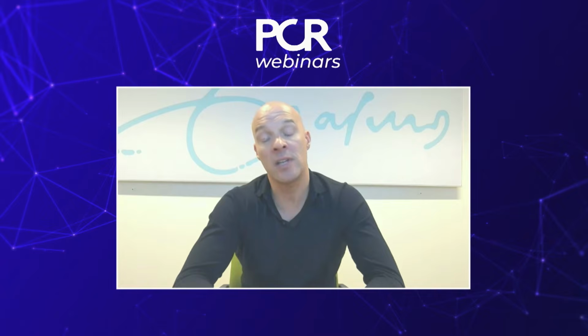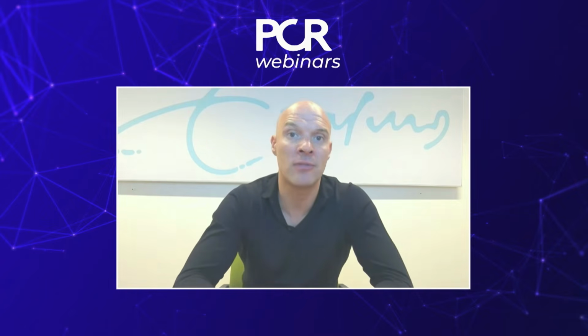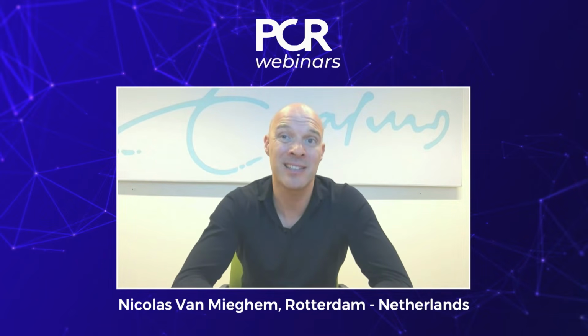Yeah, obviously. We have been doing these filter-based embolic protections for the last 10 years, so we have built quite some experience, but still, for me, there is a hard stop at 5 minutes. I don't go beyond 5 minutes of attempting to get my filters in place. Typically it requires 60 seconds, so it's very fast. But if I would need advanced maneuvering, then I give myself a maximum of 5 minutes.